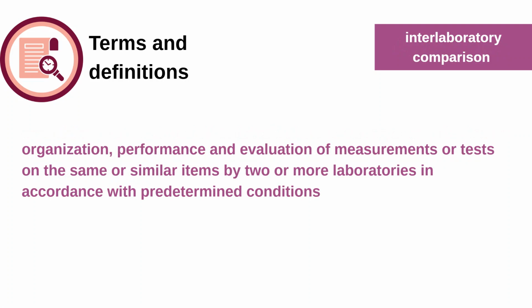For example, our lab, the Center for Biomedical Equipment Testing and Calibration in KPRIT, has equipment and does testing and calibration. Similarly, there would be some other entity, let's say named YETS. So YETS and us, KPRIT, should do a certain experiment in our lab as well as in its lab, and we have to show the result in both labs. That is the inter-laboratory comparison.